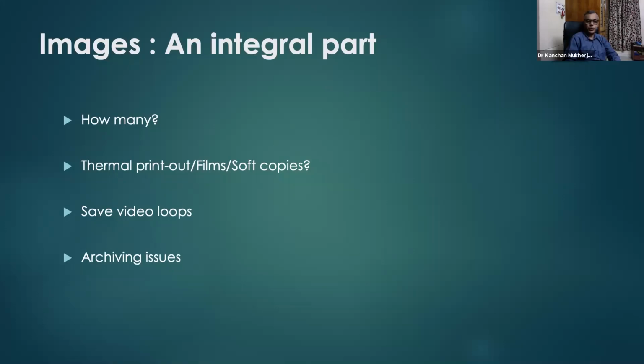Now, the next question is, do you give only thermal printouts, or do you give a radiological film, or even soft copies? Soft copies in a pen drive or a CD may last longer, but in our settings, the clinicians may not have access to the proper technology to see those. So again, I don't know the right answer for that. Whatever suits your settings, you do it.